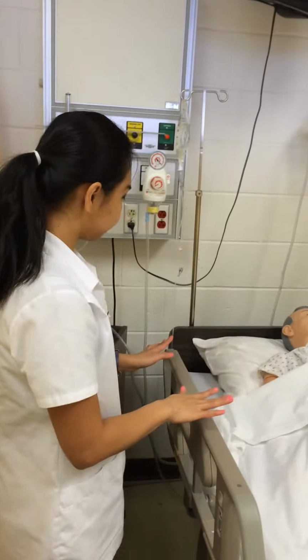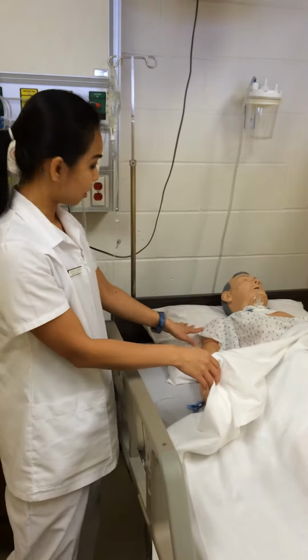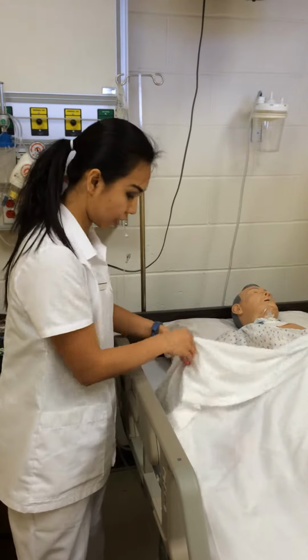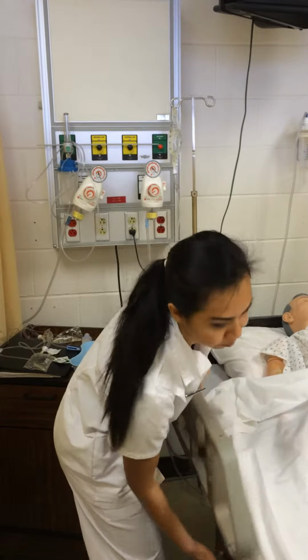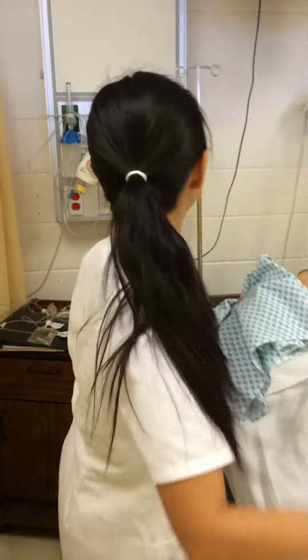So I check the patient, the IV site, everything is okay, no redness, no swelling. I lower the bed. I raise the bed up to the working height. And I am going to change the gown.